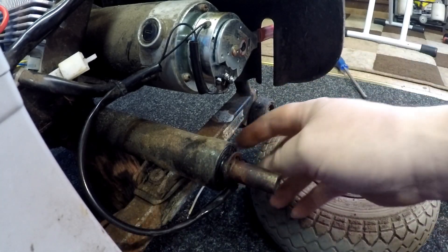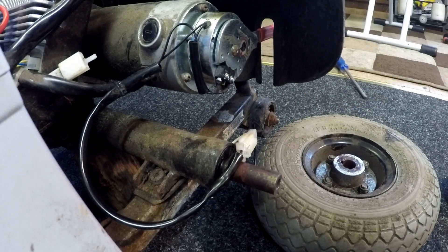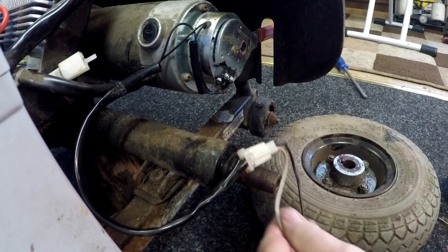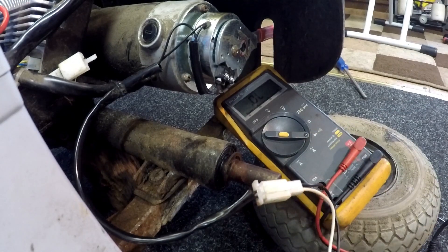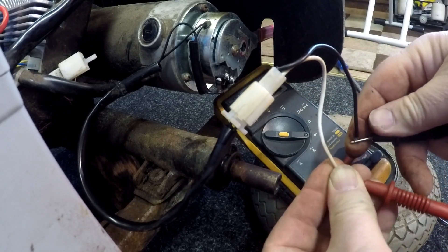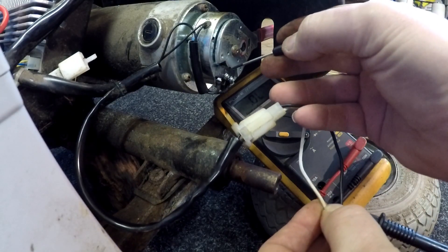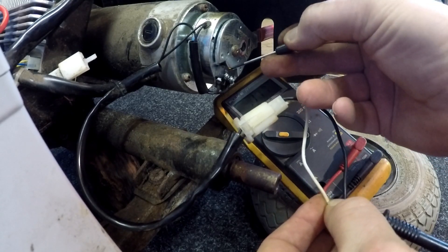I'm going to clean the shaft with emery paper before putting it back. I've now got a clear view of the micro switch and I can already see it's not sticking out properly. I'll put the multimeter on continuity again — one connection, two connections, nothing happening whatsoever. Let me hold it and have a go — there we go, that didn't take long. So once it was sitting, it had jammed in there.